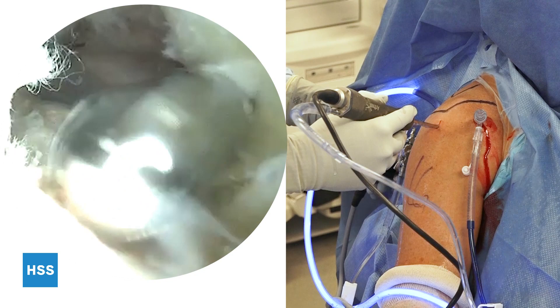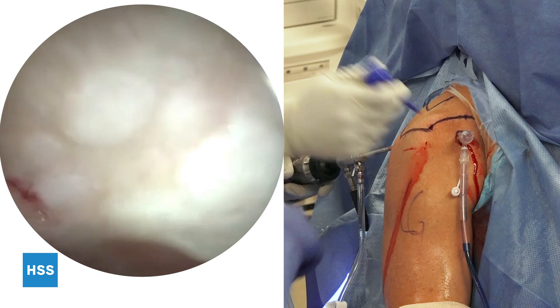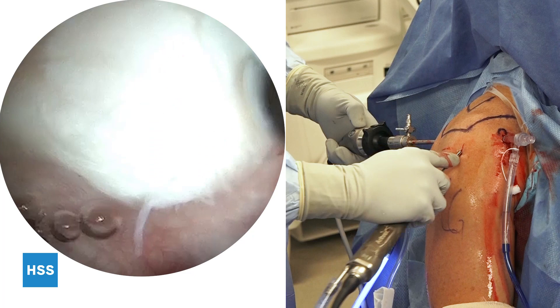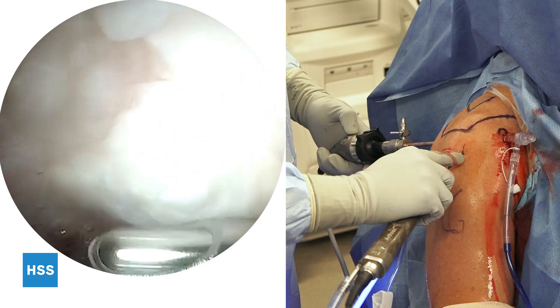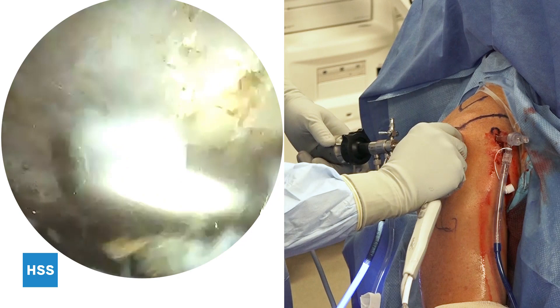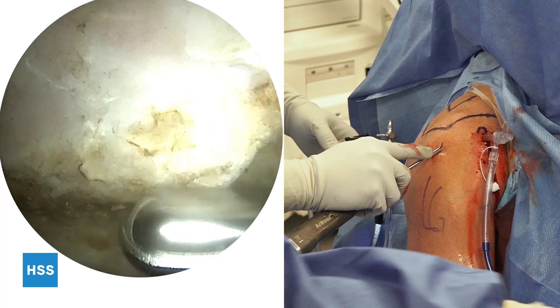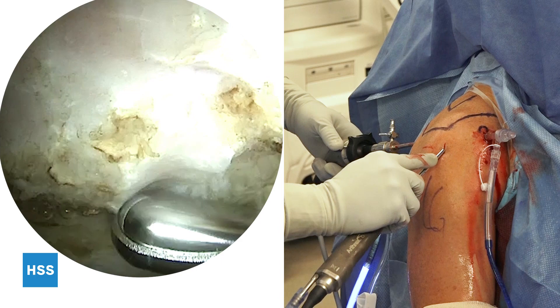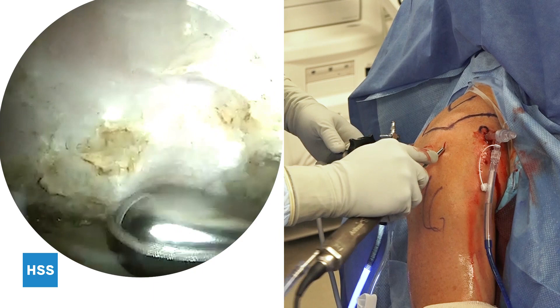Now looking in the subacromial space, we can see the undersurface of the acromion superiorly. Through the anterolateral portal, a shaver is inserted and a bursectomy takes place. Using electrocautery, the CA ligament is removed from the undersurface of the acromion. I start by exposing the anterolateral edge of the acromion — everything medial and posterior to that is tissue that needs to be debrided. A 5.5 shaver is used to perform our acromioplasty, with depth set at approximately one shaver width. This patient had a previous acromioplasty, and therefore a more minimal acromioplasty was performed.